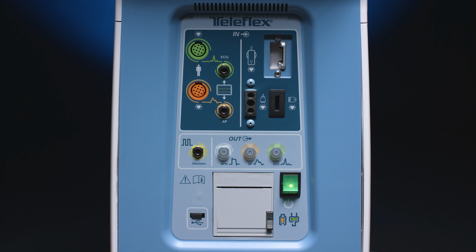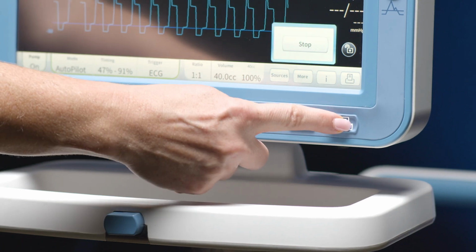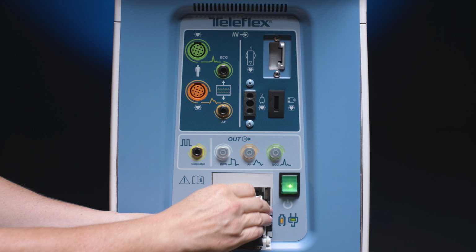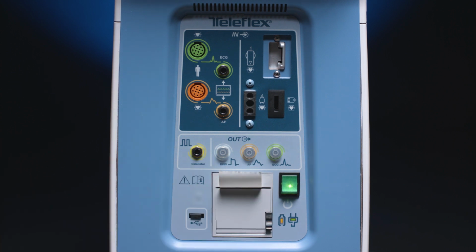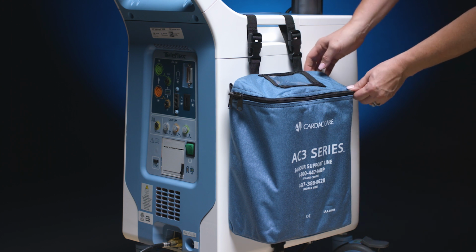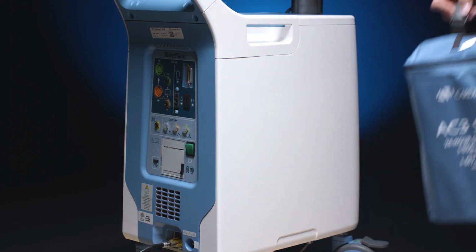The front of the module contains the following: the power switch, the AC indicator LED, and the battery charge LED, all the input and output connections required to receive the signals, and a USB connection port. A strip chart recorder is located on the front of the console. The dual-channel recorder uses 50mm wide thermal-sensitive paper. A storage pack can be attached to the side handles and used to store accessories such as cables and helium. The pack can be removed for transport to reduce weight.